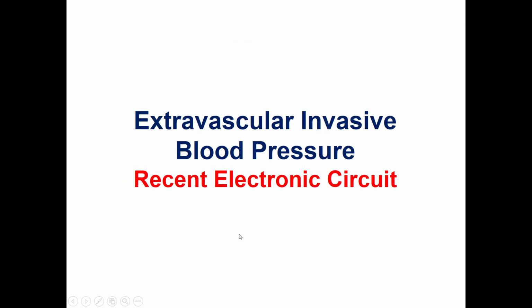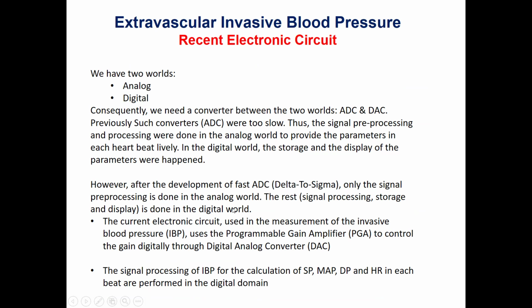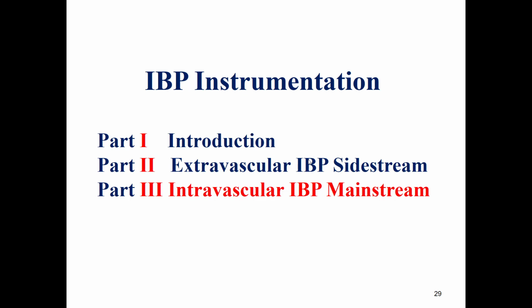But I prefer to explain both in order to understand the difference between the old and the new generation of the extravascular invasive blood pressure electronic circuit.